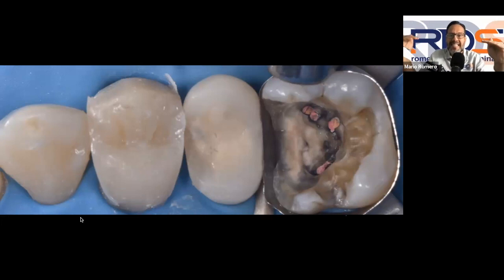So you've got to make sure that it's seated all the way down in the cervical aspect of this molar. In this particular case, I was able to get away with a W3, but another clamp that I also like is a W8A. The reason why I like the W8A is because both of its beaks are pointed more apical, which means they're going to be further away, or more apically located, in relationship to the cervical portion of the tooth. And that's going to give you an added 2 to 3 millimeters for you to be able to seat either a Mylar or any type of circumferential band system that you're going to need in order to elevate that margin.